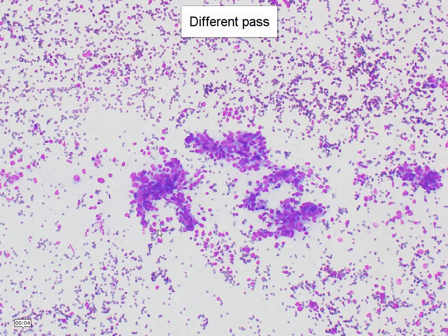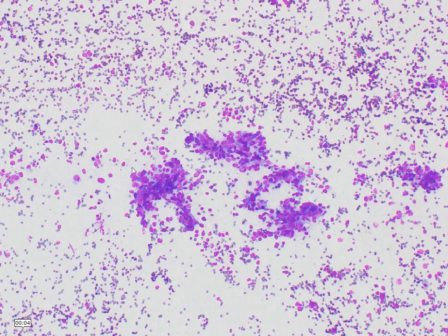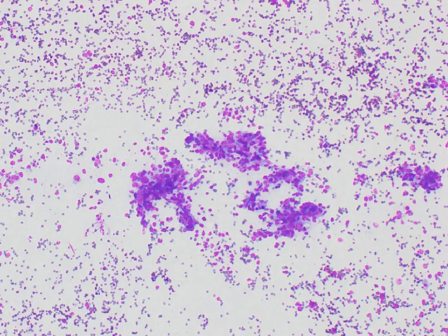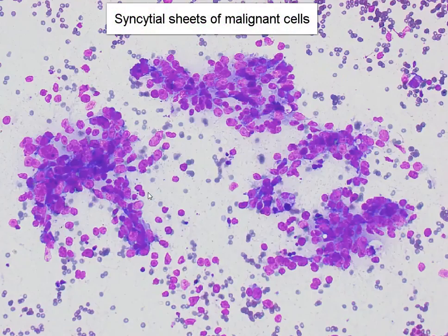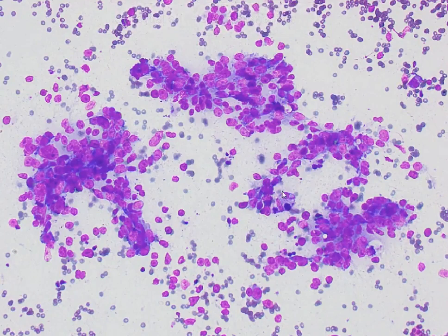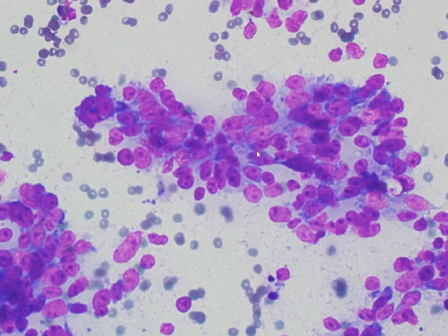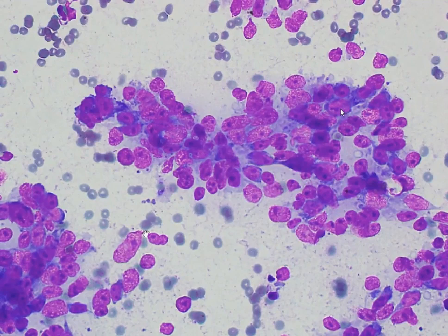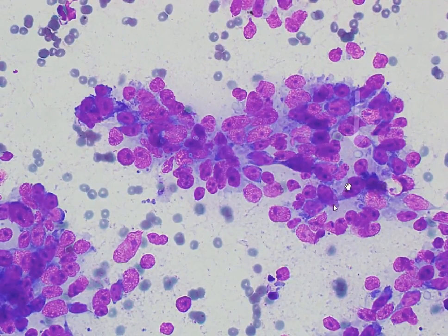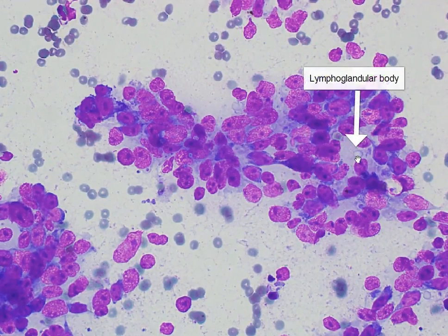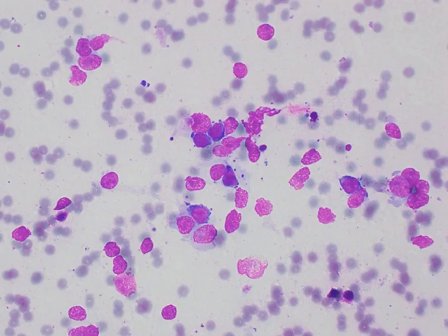This is a smear taken from a different pass, and we can see that there appears to be a more cohesive pattern in this particular smear. We have what appears to be syncytial sheets of malignant cells mixed with lymphocytes in the background, and many of the nuclei are quite ovoid with prominent nucleoli. Occasional lymphoglandular bodies are identified, but they are not a lot.